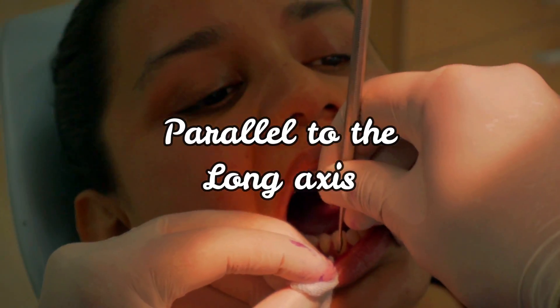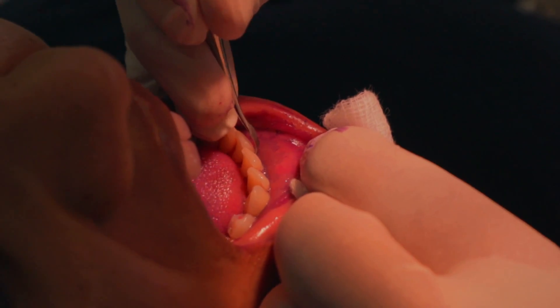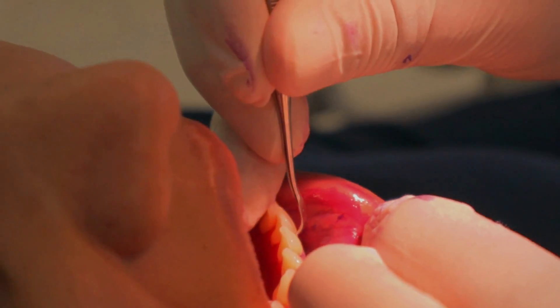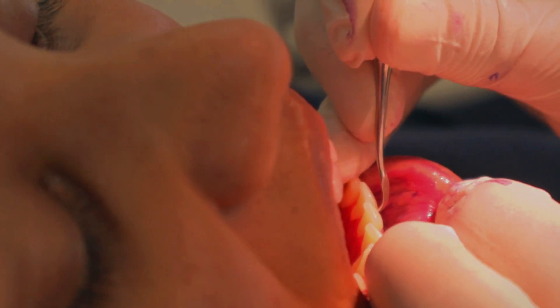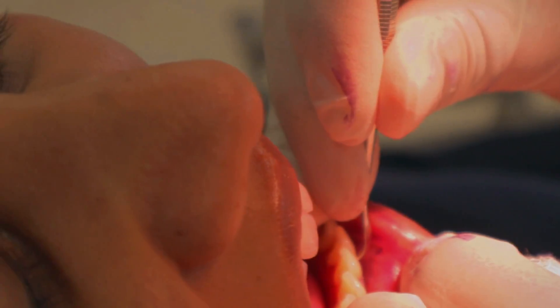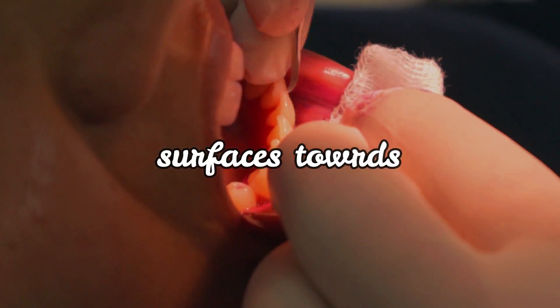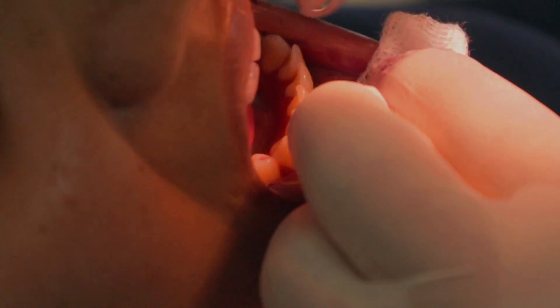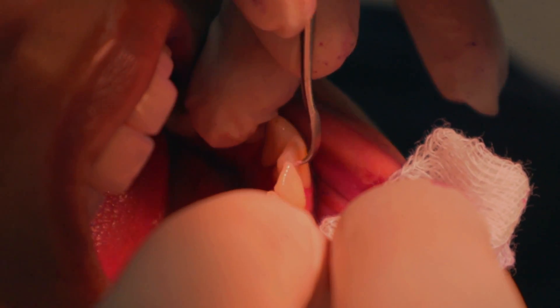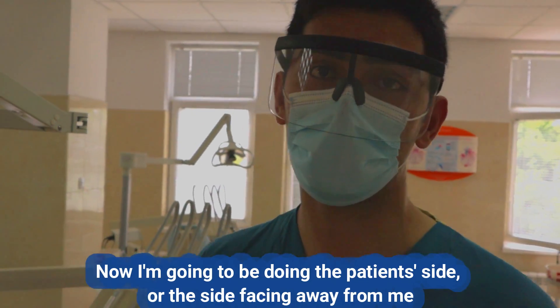The sickle scaler is held parallel to the long axis of the tooth. The tip third of the scaler's cutting edge is placed on the tooth. The instrument is tilted towards the tooth at about 70 to 80 degrees and we apply lateral pressure to activate the scaler with vertical, diagonal, and horizontal pulling strokes in a smooth motion. For best control we use two to three millimeter strokes in short continual strokes across the surface of the tooth. First we do the side facing the dentist and then the surface facing away from the dentist. You can see as I'm scaling the teeth going upwards — the calculus just drops on the sickle scaler, coming out so smooth.